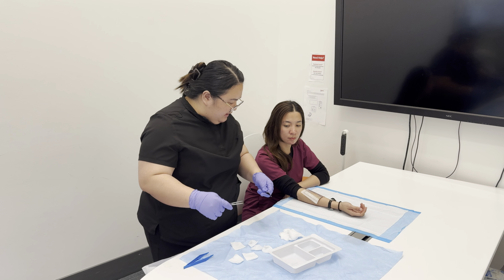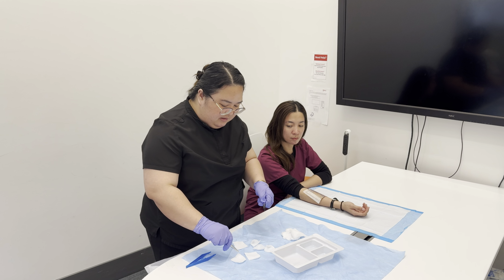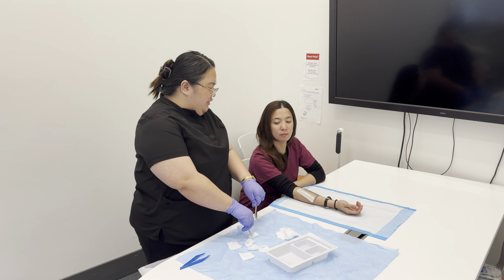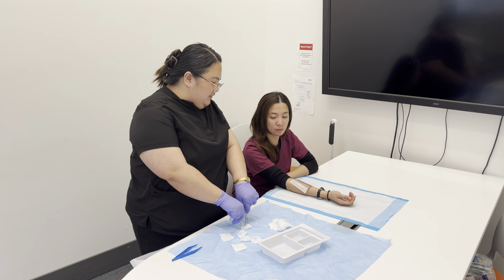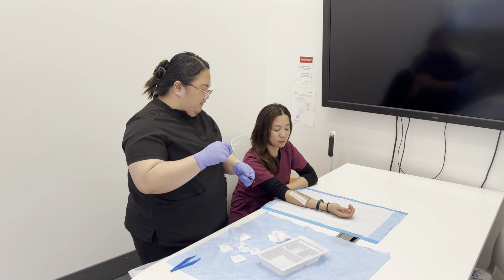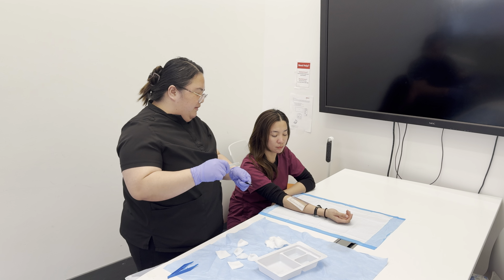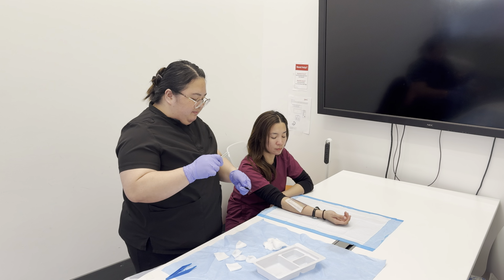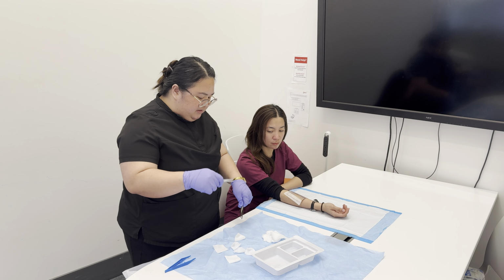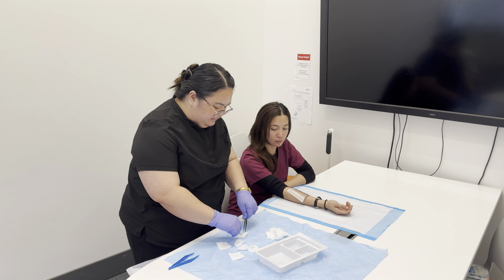Then I'll now start using a small gauze, and when you're cleaning, we'll use the technique of cleaning from the least contaminated to the most contaminated, and from head to toe. Then the method will be the dumpling method, and then roll it when you're cleaning it.